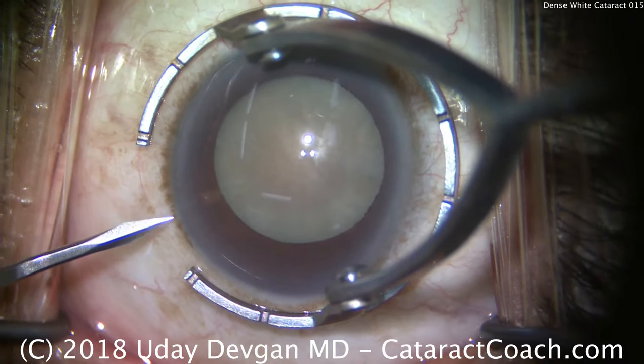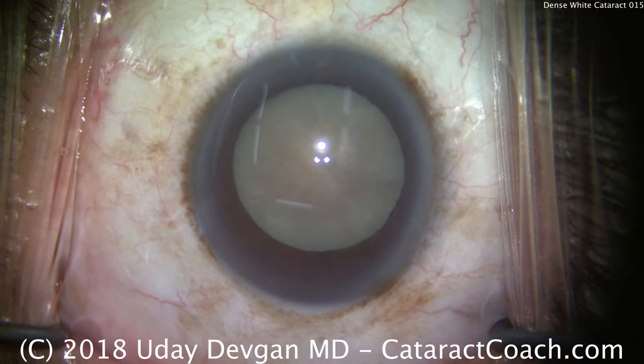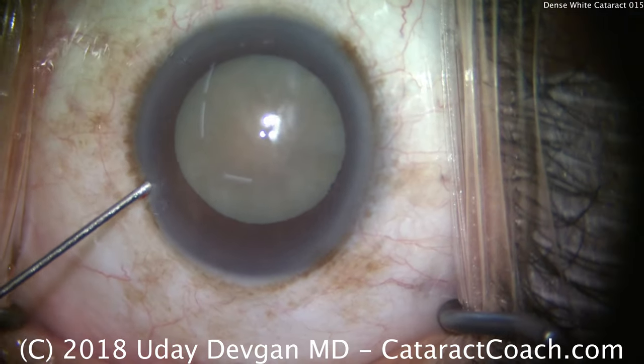It's Dr. Devgan, your cataract coach, with a white cataract. But look at the color — it's white, but more on the slightly yellow or brown scale. That's important, and I'll tell you why.